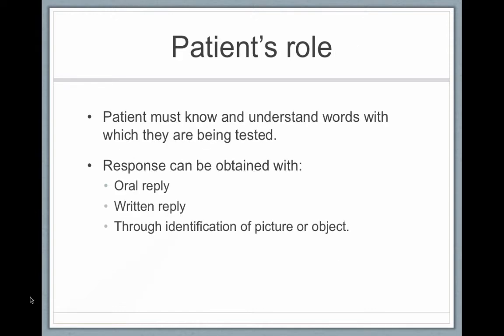The patient has to know and understand the words that they're being tested on. So these word tests are not tests of vocabulary. I don't care if you understand the word, if you know what the meaning of a word is. I just want you to be able to hear the word and repeat the word. Okay, so speech audiometry is not a test of a person's vocabulary.